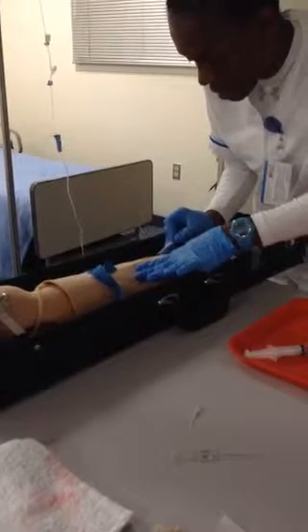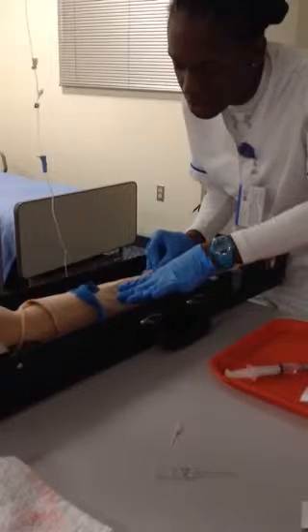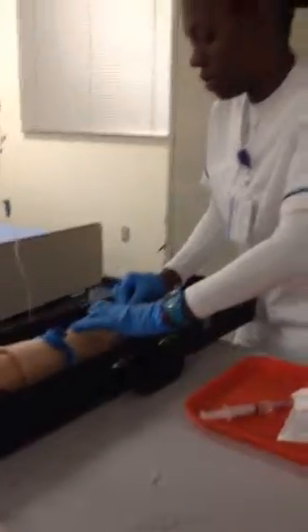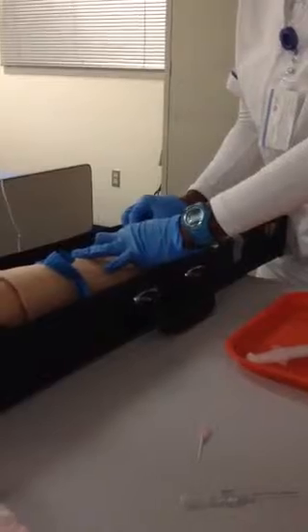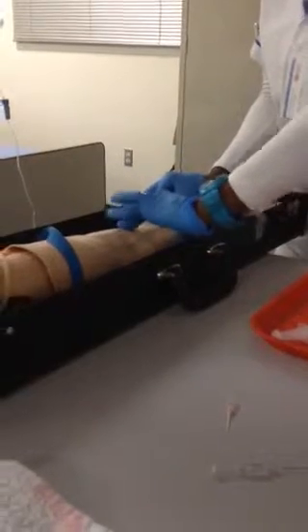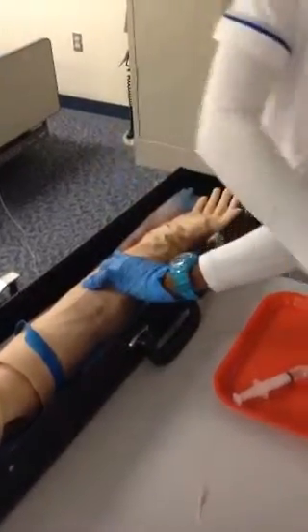I'm going to go in at a 15-degree angle. Once I get flashback, I'm going to push it down and proceed forward. Once I'm in there, I'm going to stabilize. As I do that, I'll pull the needle out a little, holding and stabilizing it. I'll pop my tourniquet, occluding the vein, so that nothing pops out. I'll remove my needle and dispose of it in my sharps container.